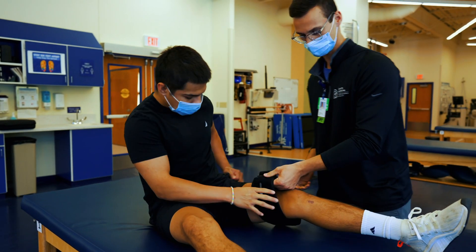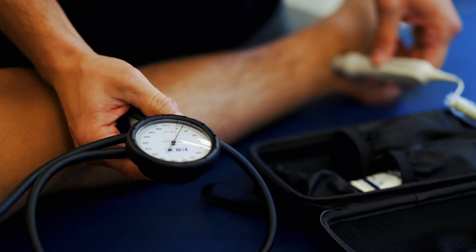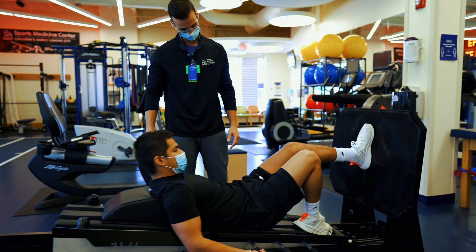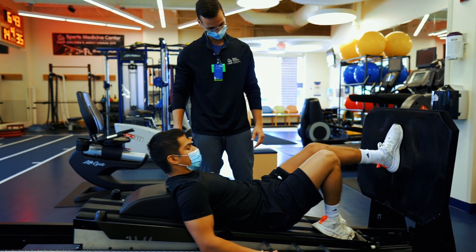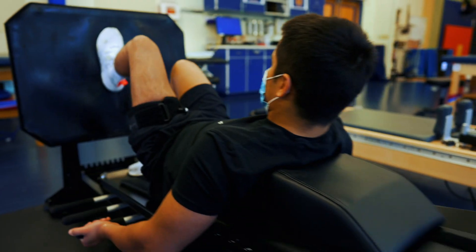BFR training involves using a cuff to restrict blood flow to an extremity, putting a patient through low-intensity exercise to produce the same metabolic effects typically seen with high-intensity training, but at a much lower effort level. A great example of when we use BFR training is with our post-operative patients early on after surgery, when it might be unsafe to load them with heavy weights to build strength.